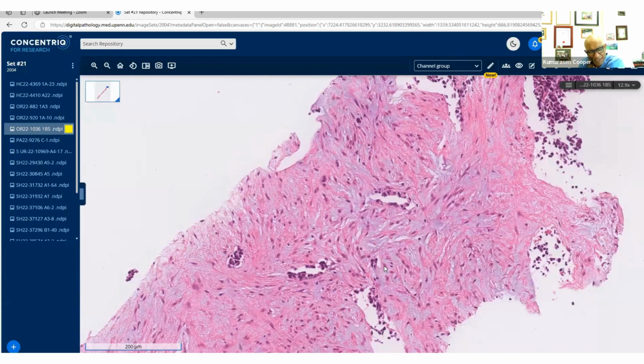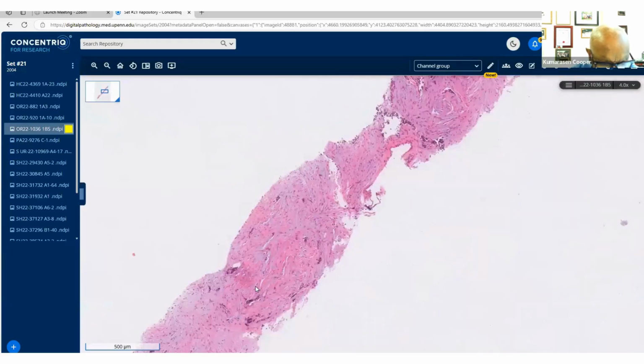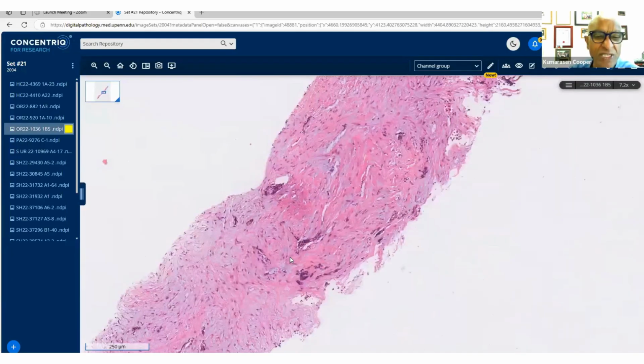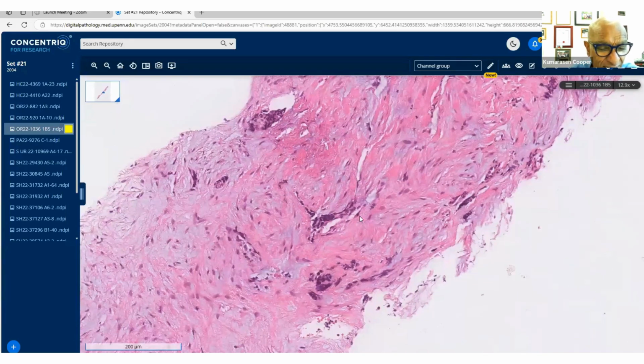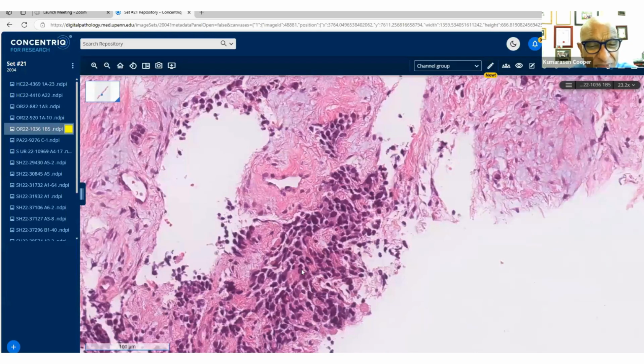And there are several examples like that. I always quote the malignant melanoma of soft parts, which Dr. Enzinger described 40 years ago, and how those were confirmed with molecular analysis, and so on. But that's me going on my historical quest. Okay, any questions on this? It's just a nice, lovely example of desmoplastic small round blue cell tumor. We probably see one every 2 or 3 years. They're very rare, and the oncologists know how to treat them, and they have regimens for these. So these are the small round blue cell tumors here. All right.